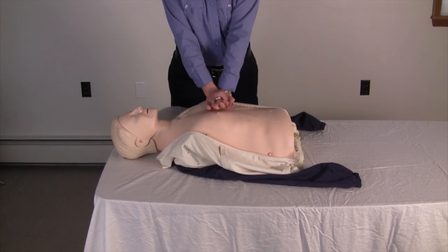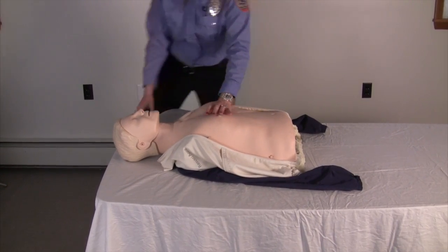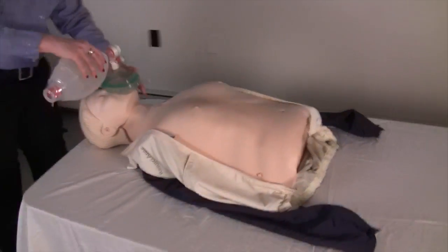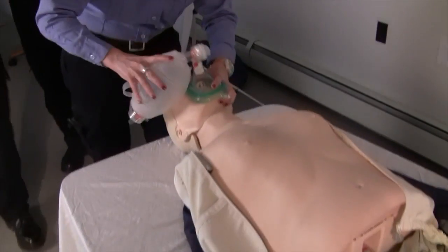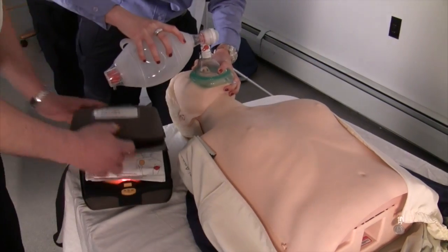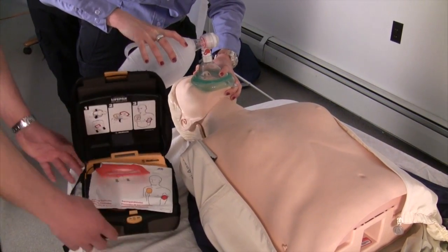After 30 compressions, the rescuer opens the airway using the head tilt, chin lift, and ventilates twice. A successful ventilation occurs when the chest rises with each breath.